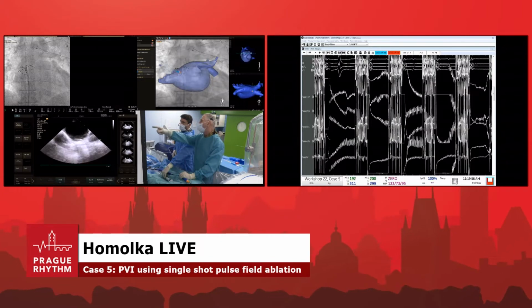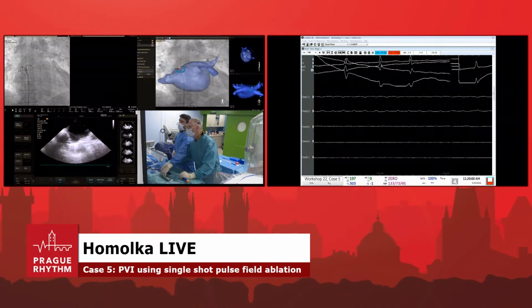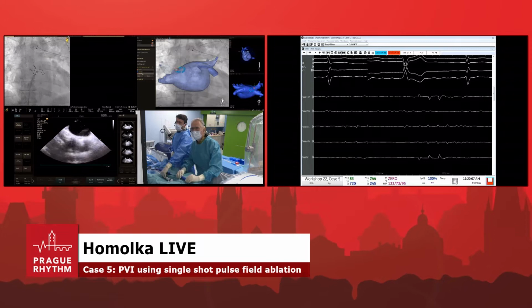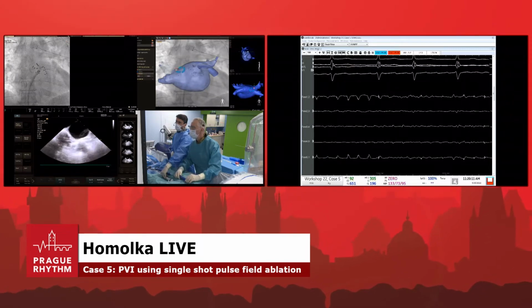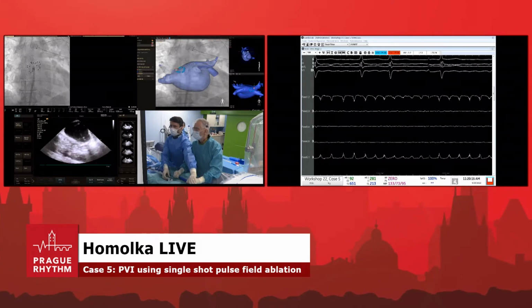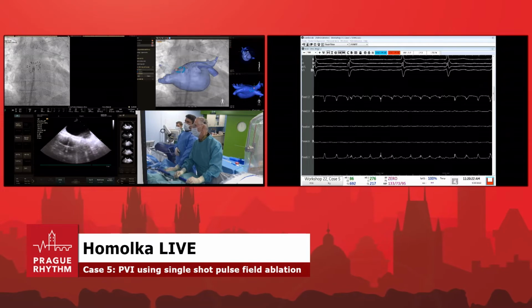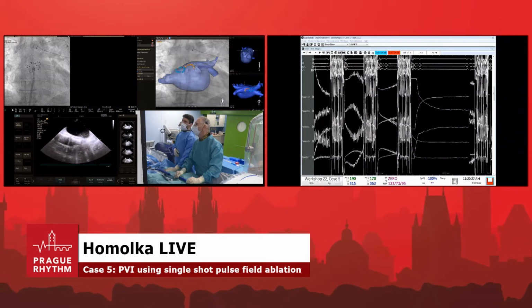And actually the guys are marking the position. Okay, perfect. Wipe out all signals on the posterior wall, based on this integration of CT images. Okay, let's go. It's like a box lesion, more or less. Now, I hate box lesions with RF, but I love this posterior wall application of PFA, I must say. Let's go, application. Let's mark the position again, and we need to overlap, okay?